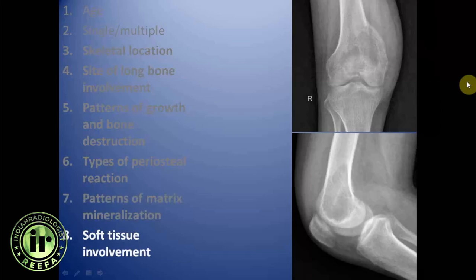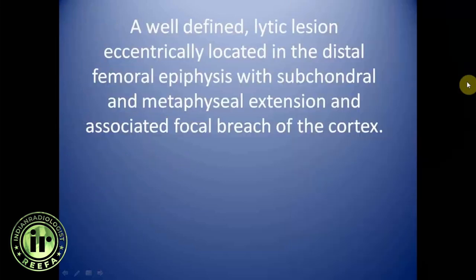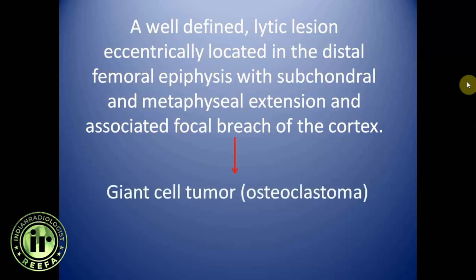There is slight soft tissue involvement in the popliteal region due to cortical breach. This is a well-defined lytic lesion eccentrically located in the distal femoral epiphysis with subchondral and metaphyseal extension and associated focal breach of the cortex. Radiographically, this is giant cell tumor (osteoclastoma), but differentials to consider include chondroblastoma, aneurysmal bone cyst, and brown tumor of hyperparathyroidism.